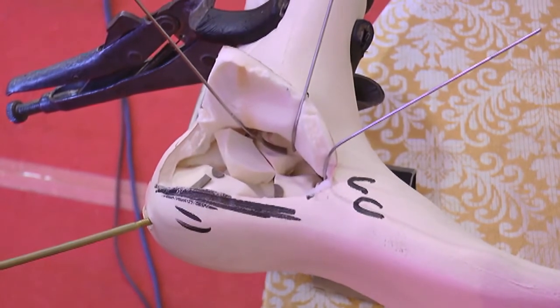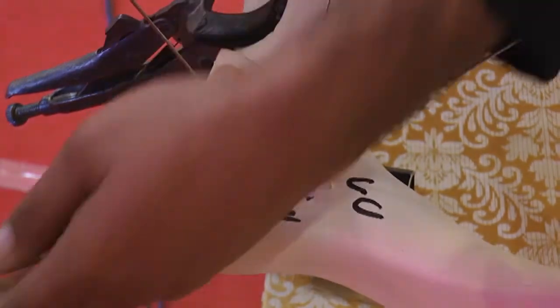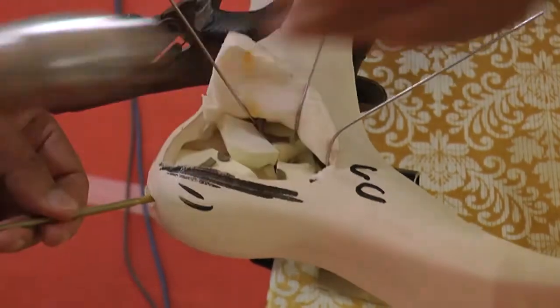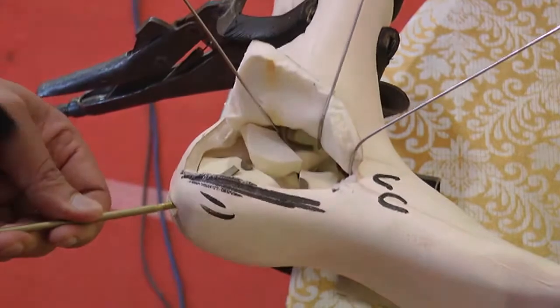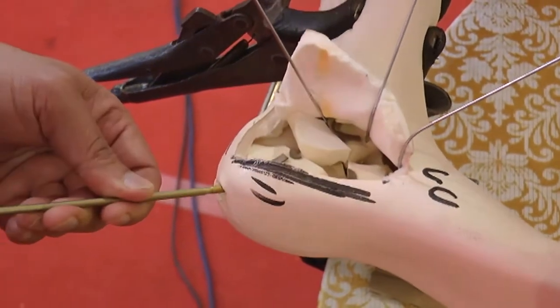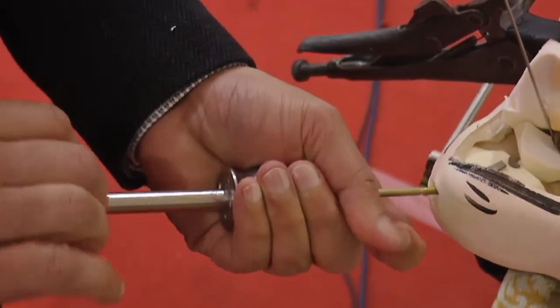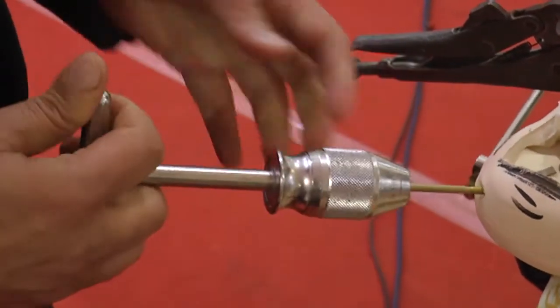So you have not still entered the sustentacular fragment. So you have reached up to the fracture where in the axial view now you are seeing that the Steinmann pin is about to reach the sustentacular fragment.